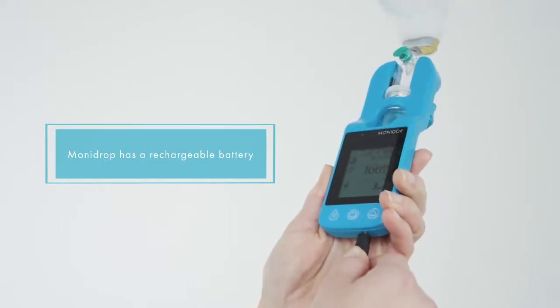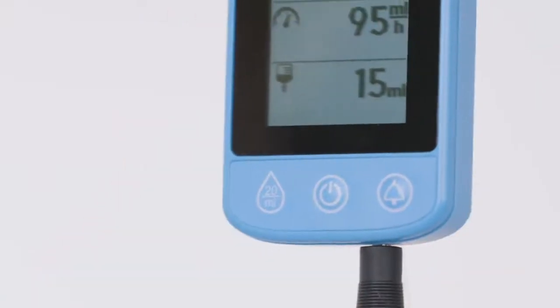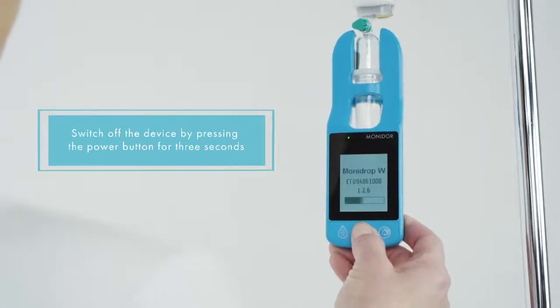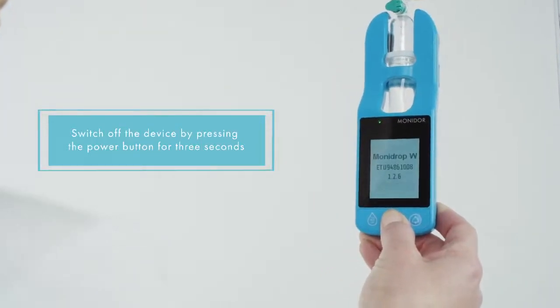MoniDrop has a rechargeable battery, and this can also be used at the time of charging. Switch off the device by pressing the power button for three seconds.